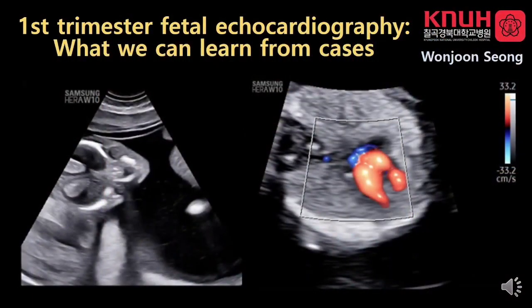Hello everyone. First of all, it's a great honor for me to join this webinar. I think I am a novice in this field because I've used only transabdominal ultrasound for screening until recently. Actually, I don't use a linear or high-frequency probe. I'm using a standard probe just like most of you. So my video clips may not be as good as you expect, but if you think the other way around, my cases can be helpful at the level of screening using the transabdominal approach. Let me share my short experiences with some small cases.